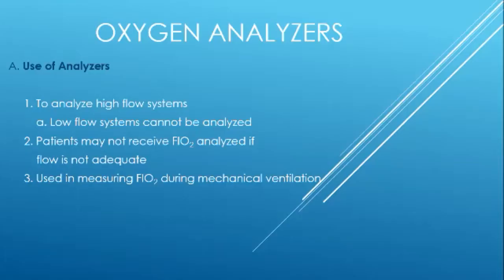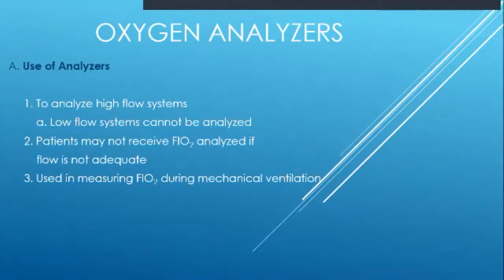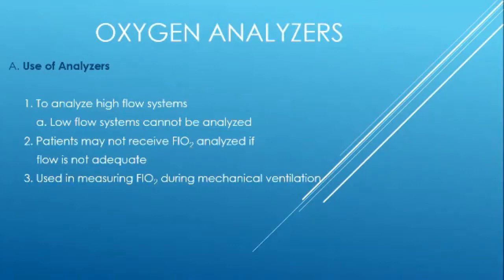Oxygen analyzers are used to analyze high flow systems. We don't use them in low flow systems. We use oxygen analyzers to analyze the oxygen in a high flow system, whether it's a Venturi, or we're not sure, or it is an aerosol face tent, aerosol T-piece, aerosol trach collar, face mask. All of those things, if they don't say it on the machine, we need to be able to analyze it. If it's a tandem or whatever is going on, we can analyze it.